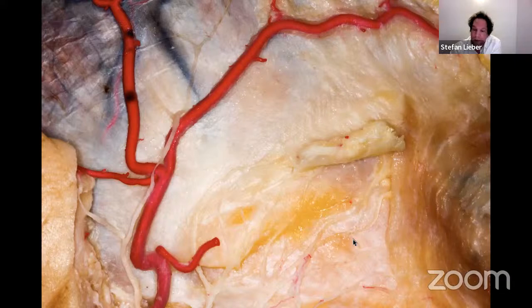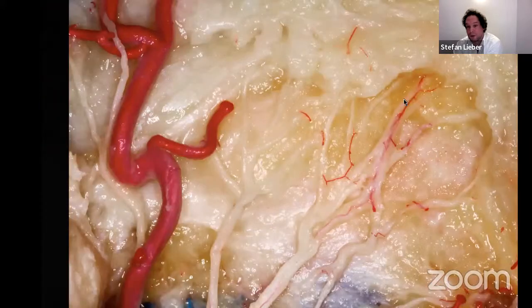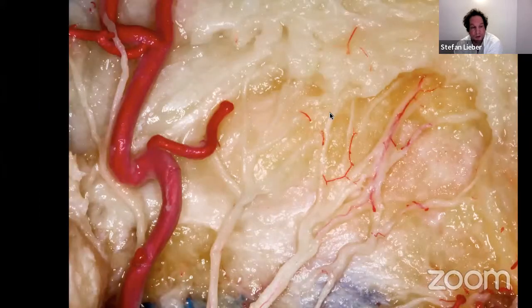This is the deep fascial layer, and in this vast fat pad, there is a big number of facial fibers, which are impossible to control once entered. They're too thin. They are in the fat pad and cannot be visualized even under the microscope. So it's important to recognize the layers and not enter into this fat pad. This is just a depiction of these fibers running in the fat to outline the fact that it's not possible to dissect them even under the microscope in a surgical setting.